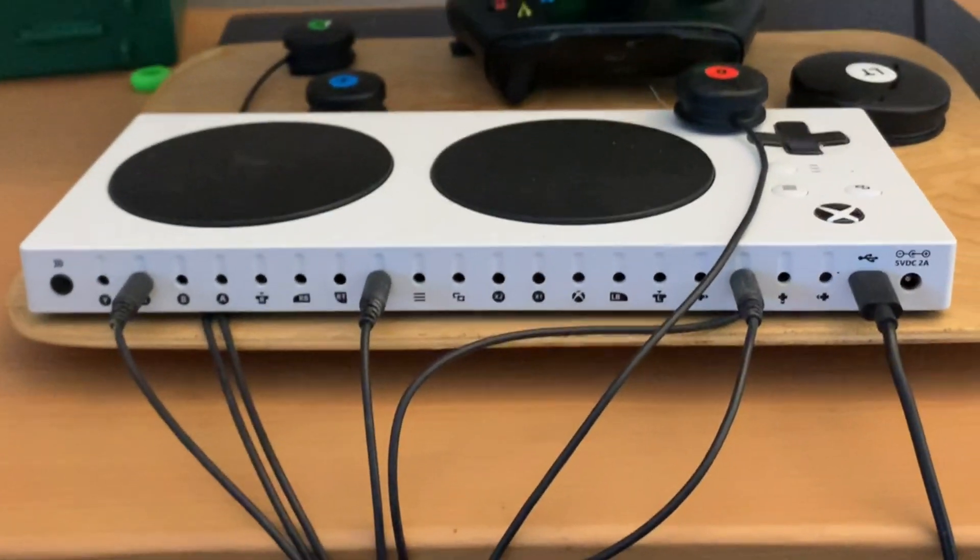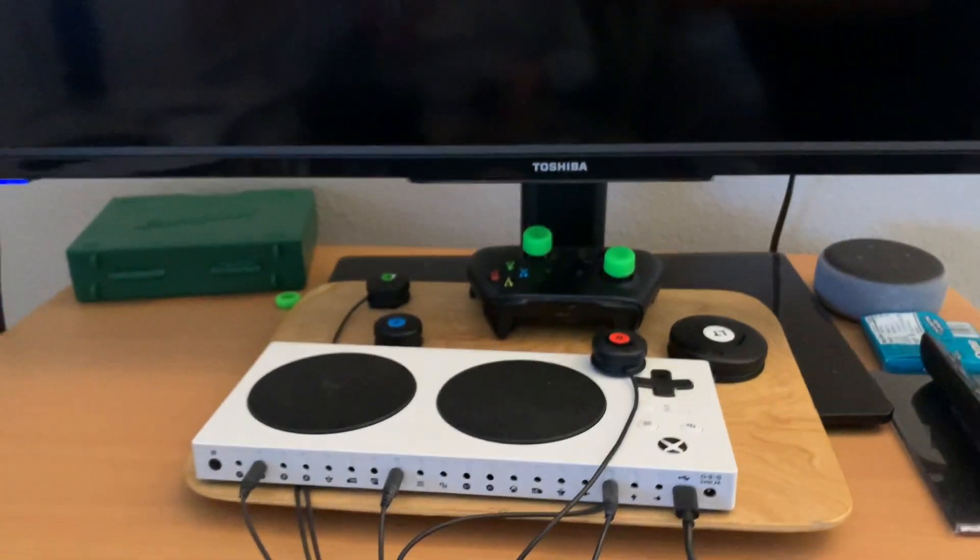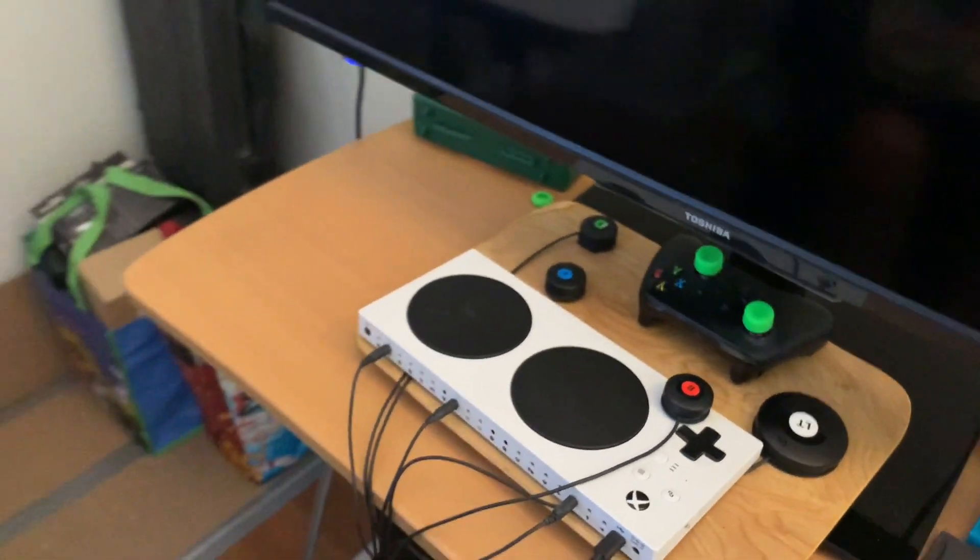Those are the ports where I can plug the other end of the sip and puff in. I can plug it into ports like A or B, X and Y, or R and T. For the games I play, I use the sip for shooting and the puff for B, depending on which game I play — either Call of Duty or Halo.